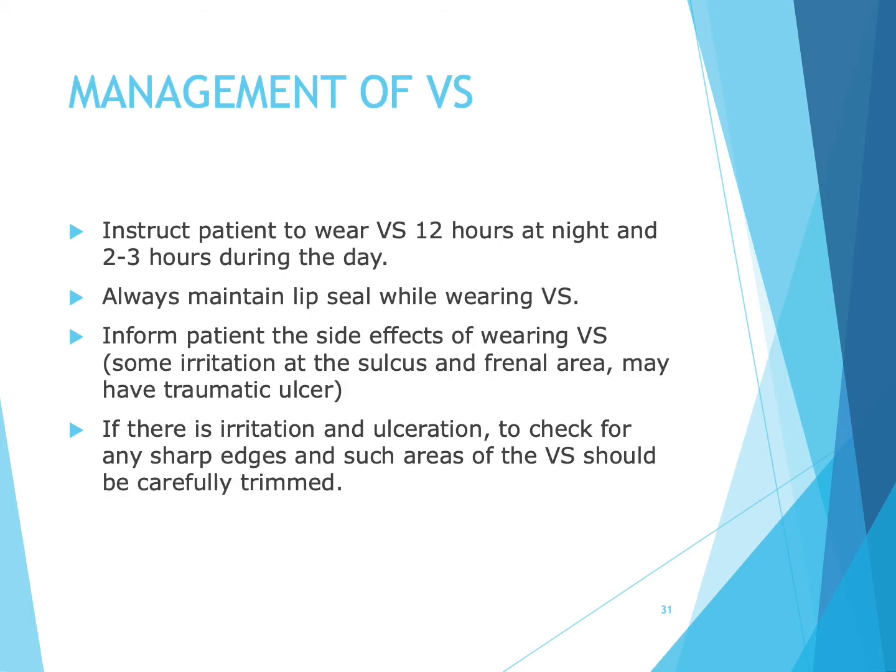Management of vestibular screen. Firstly, we need to instruct the patient to wear the vestibular screen 12 hours at night and 2 to 3 hours during the day. Always maintain lip seal while wearing the vestibular screen. Inform the patient of the side effects of wearing the vestibular screen.